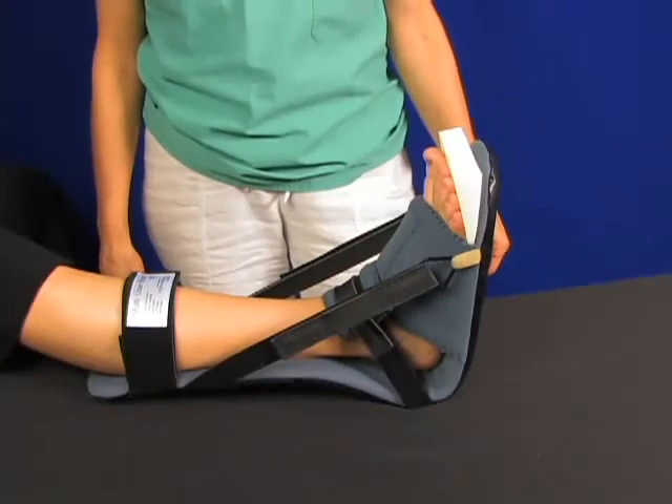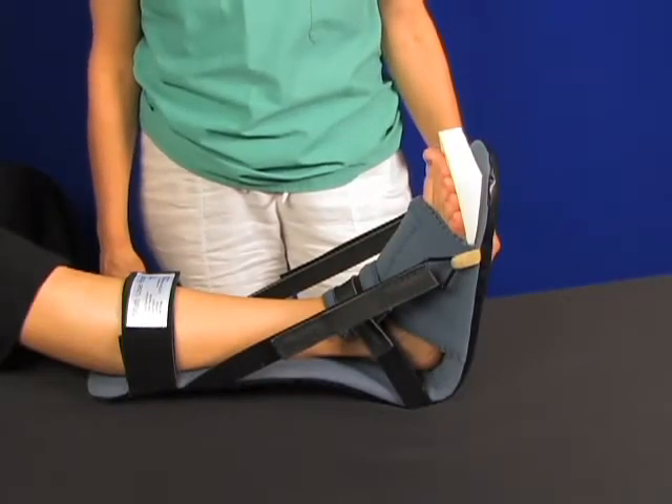Clinical indications include ankle contracture, heel decubitus, and plantar fasciitis, to name a few.